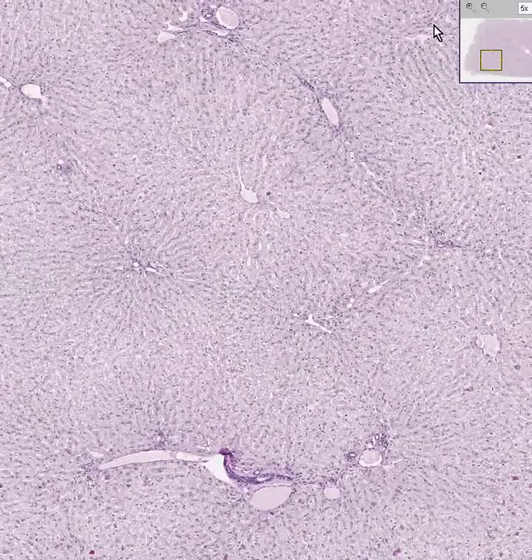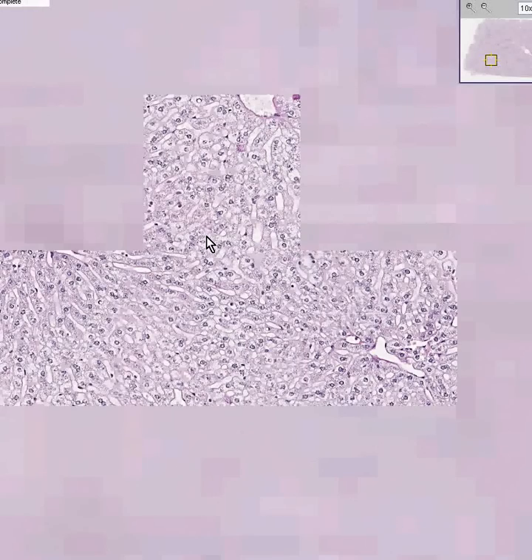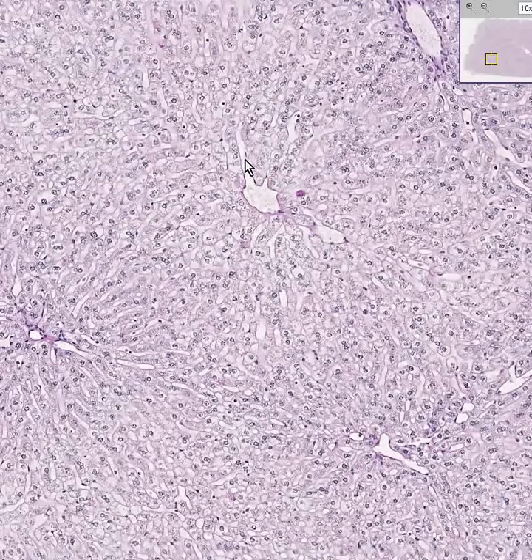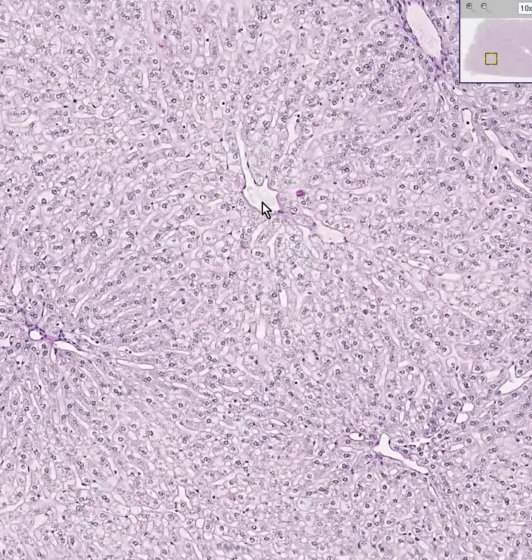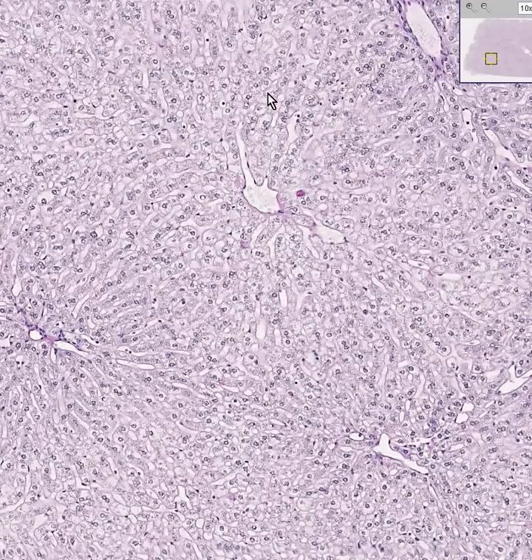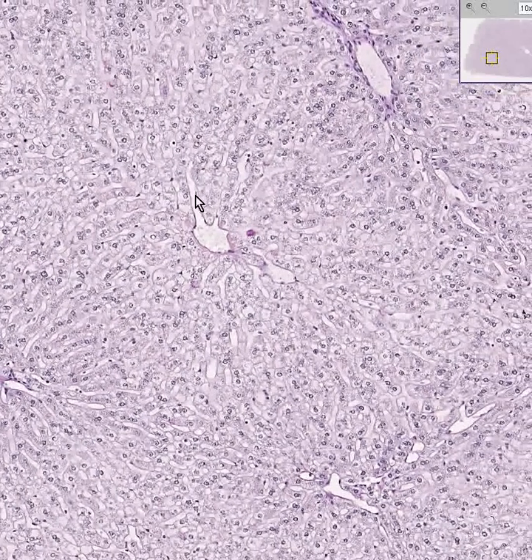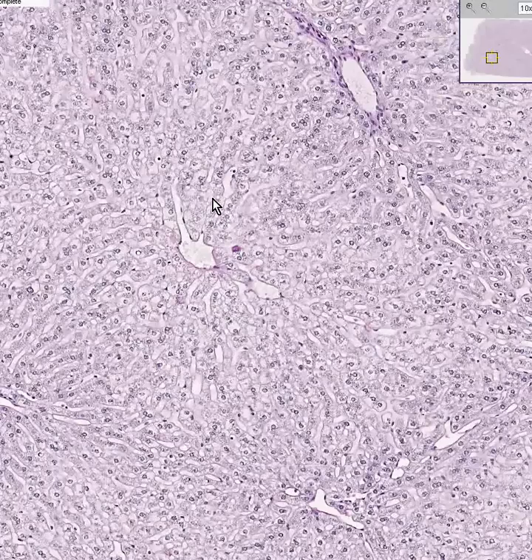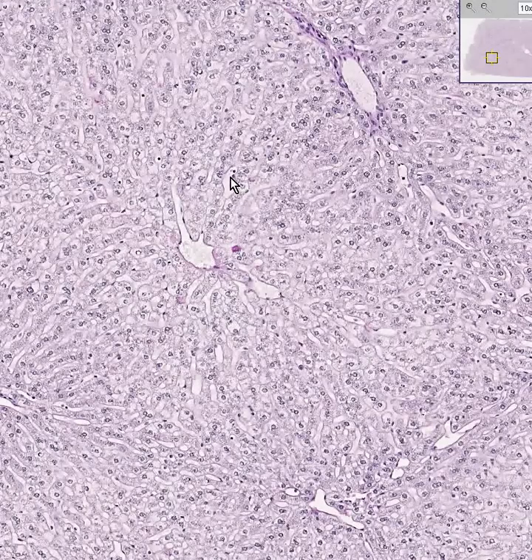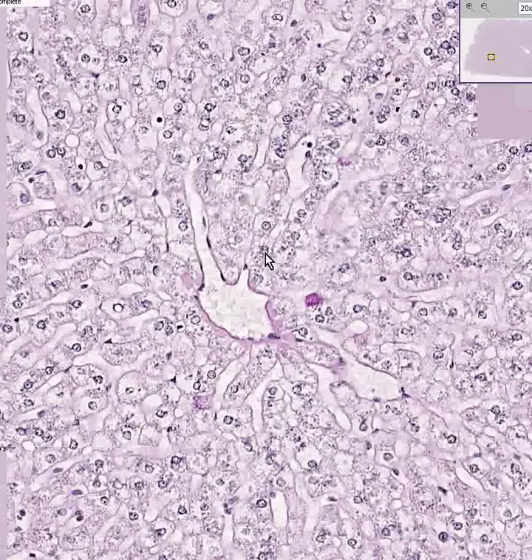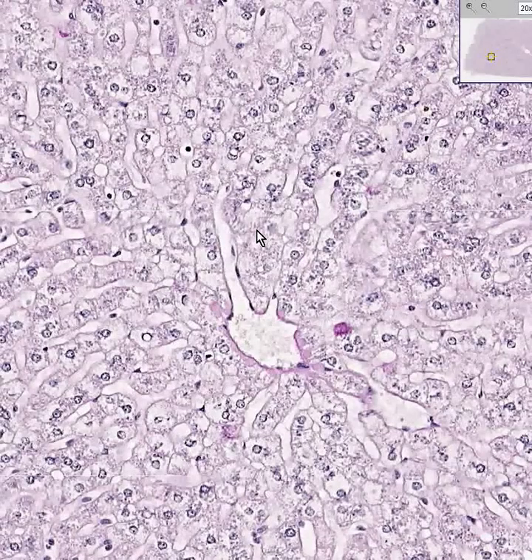Let's look at the center portion of the lobule. Here is the central vein. Here is a sinusoid opening into a central vein. Here all these cells with central round nuclei are hepatocytes. All of these cells near the hepatocytes, which have sort of spindly nuclei, are going to be Kupffer cells, or the so-called reticuloendothelial cells.